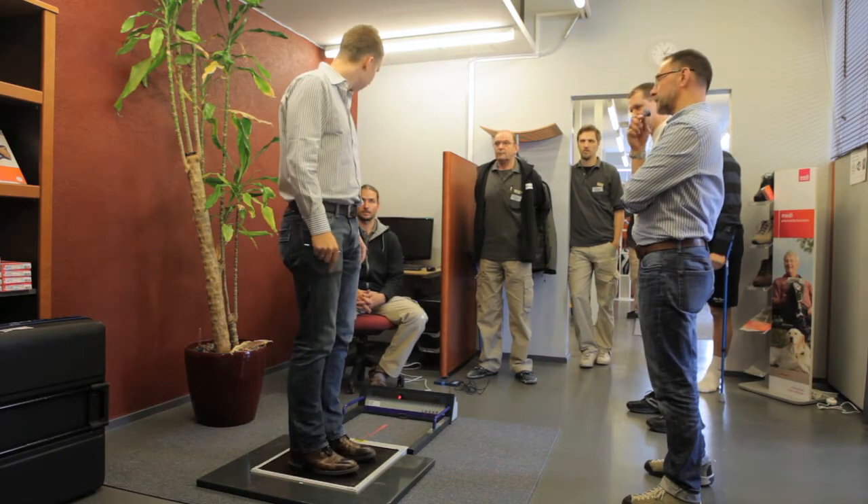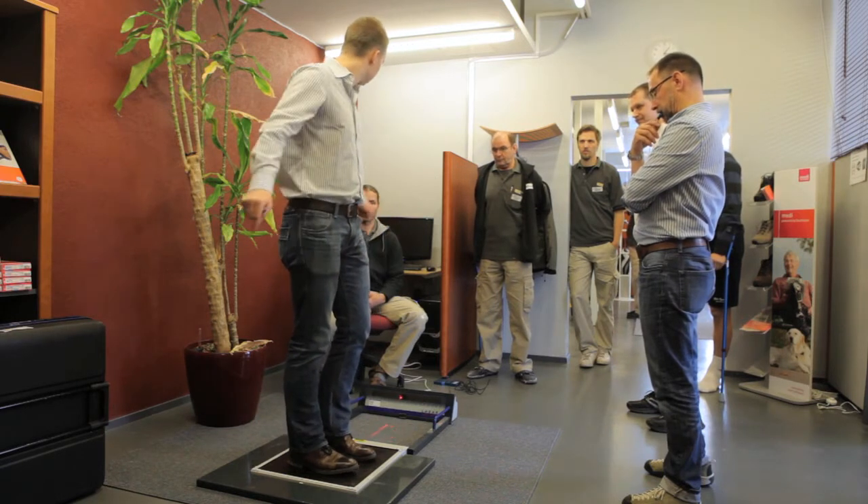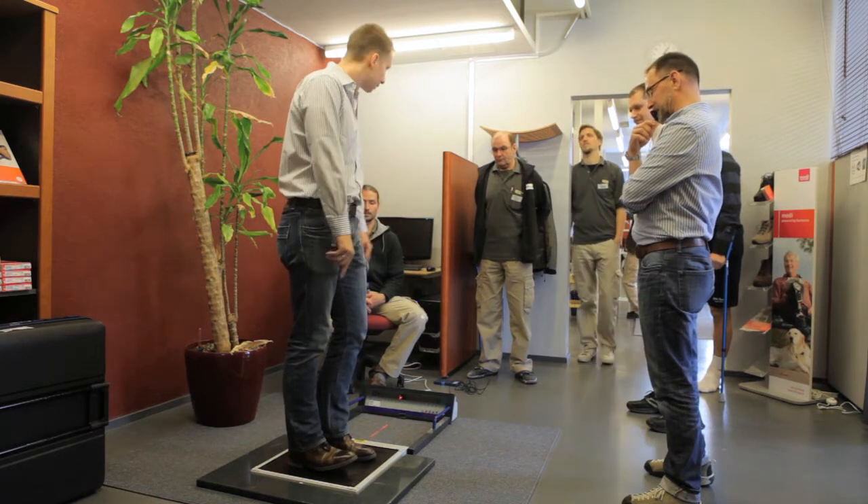If I have a bad prosthetic alignment, something like that — it's not easy to stand, so I will compensate with my other side. That's extreme now.